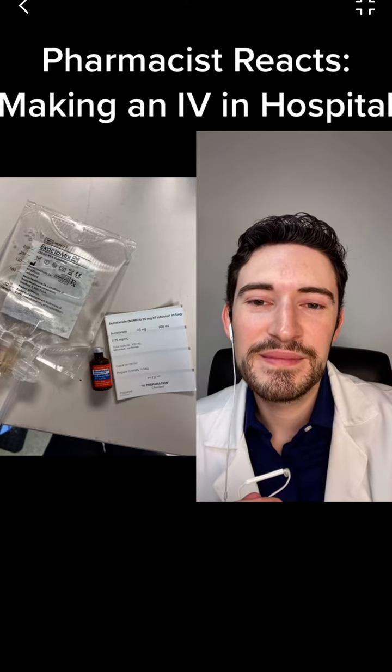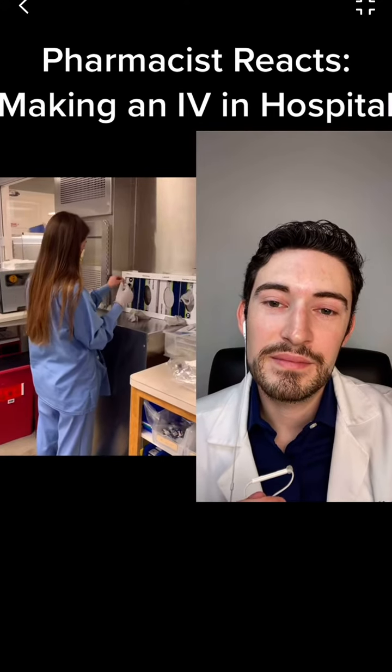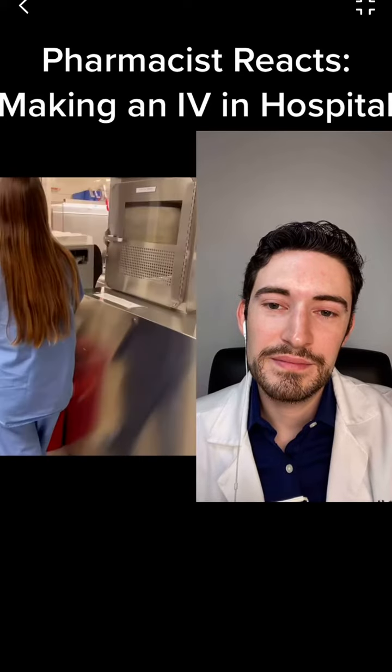Let's see what's going on. Make an IV with me in 5 times speed. First, we're going to verify the order. Then we have a tech who's going to grab some of our materials that we need.